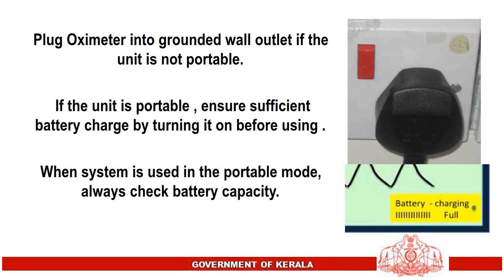Plug the oximeter into a grounded wall outlet if the unit is not portable. If the unit is portable, ensure sufficient battery charge by turning it on before using. When the system is used in portable mode, always check battery capacity.